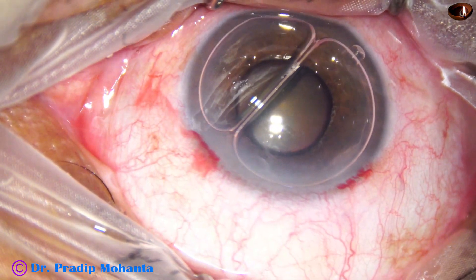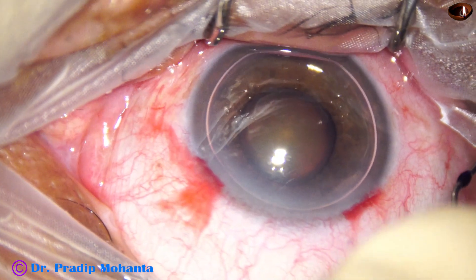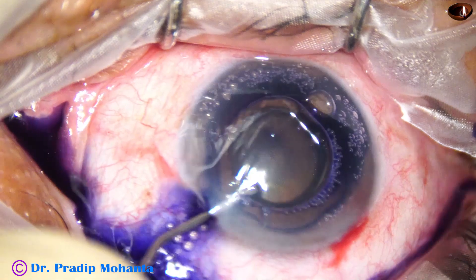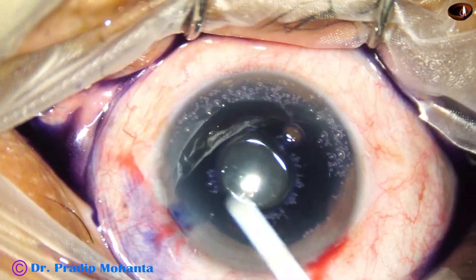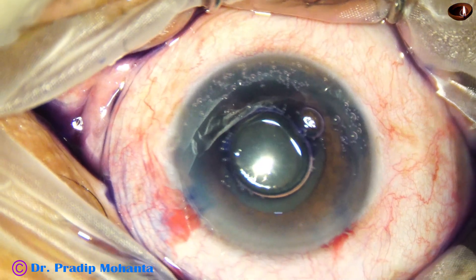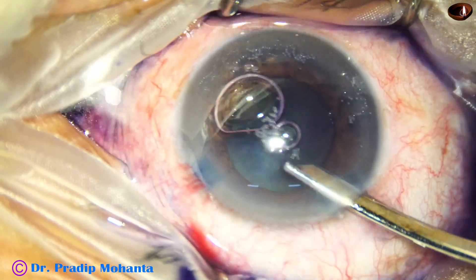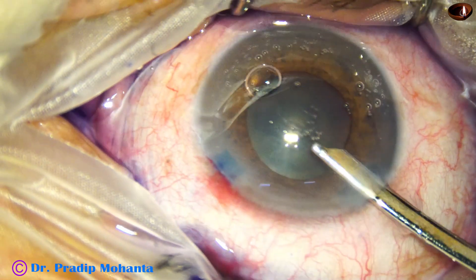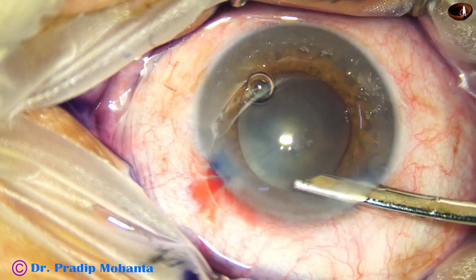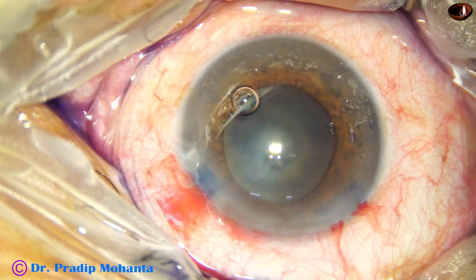I am planning to stain the anterior capsule with trypan blue dye. I always stain the anterior capsule underneath an air bubble. The staining is quicker and nice in a short time. I always wash the excess dye out of the anterior chamber — this reduces TASS, toxic anterior segment syndrome.